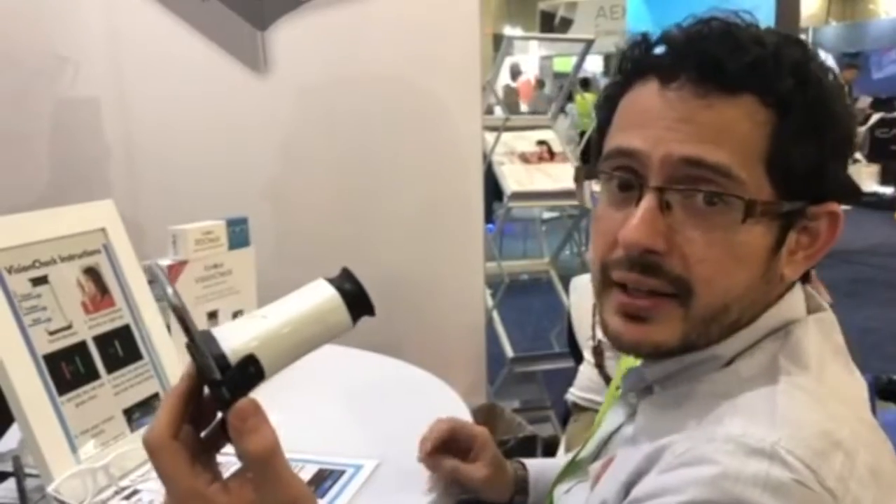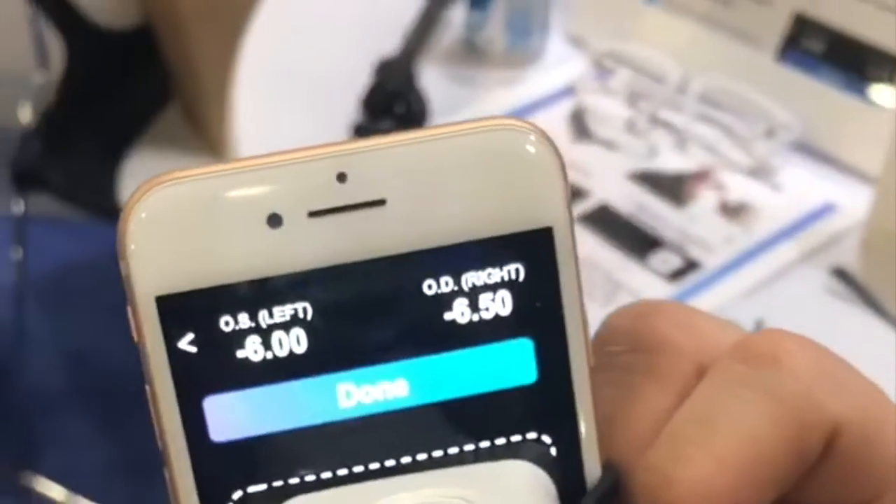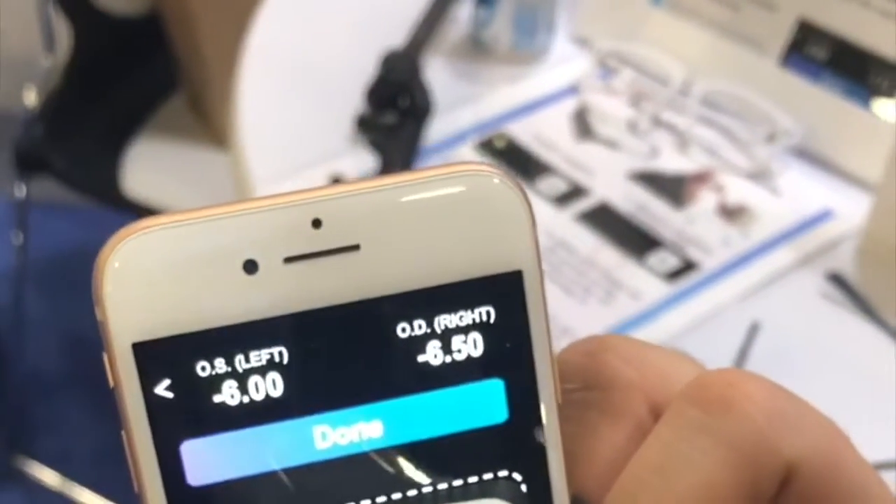I thought it was very intuitive and easy to use. As opposed to looking at an eye chart where sometimes you're not sure which letter you see, with the red and green I was very sure. The result was negative 6 in the left and negative 6.5 in the right — pretty close to my prescription. I just got it done a month ago and it's pretty much the same.